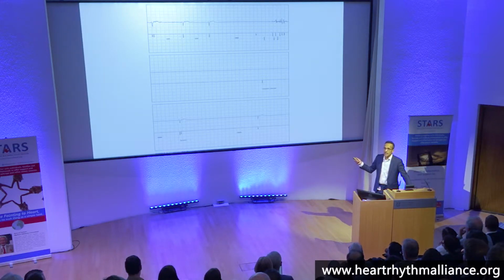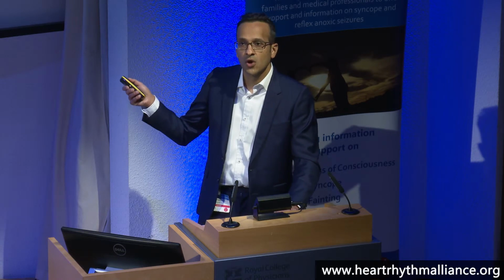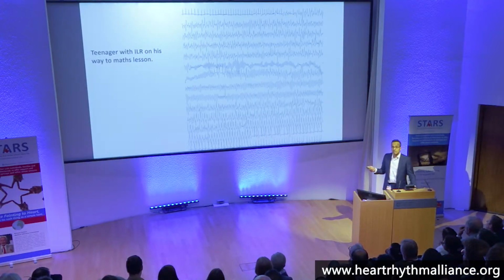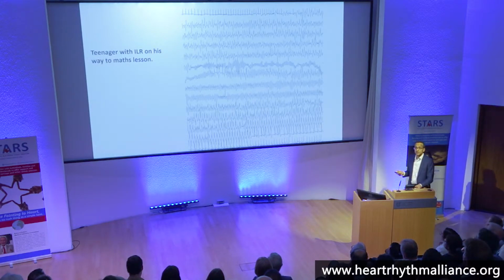Okay, so the other caveat to this is really only monitor your patients if you really believe you're going to act on it if you find something like this. Okay, because this caused him a lot of angst and upset, and that's why he came down for a second opinion. More can come to the fore in loop recorder implantation. It's not always about pauses and pacing.